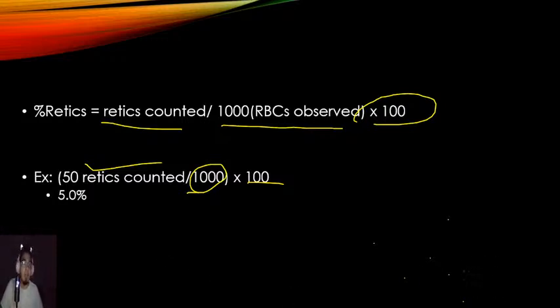Alright, so I need to count probably around 8.5 or probably 11.5 fields, something like that. I don't need to include half of the field. Practically speaking, that's easier, and if you're working in a very toxic environment where there's a lot of samples being submitted, you cannot count 1,000 or 100 cells per field.